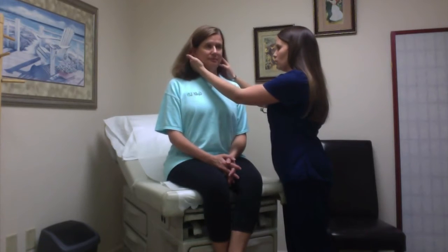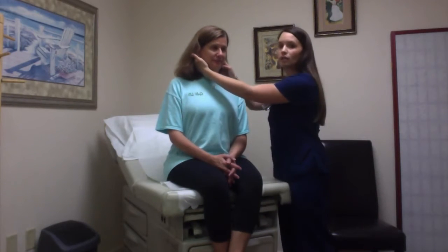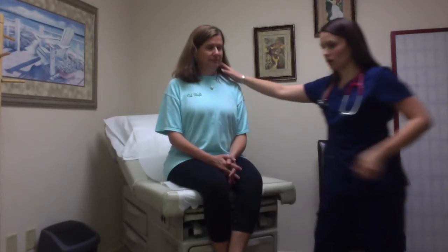Okay, so next we're going to be doing the assessment of her ears. I'm going to start by inspecting the auricle of each ear, just for any nodules, lesions, just general hygiene. I'll do both sides. Are you feeling any tenderness in your ears? No tenderness. Okay, so I'm also palpating. I'm going to palpate your mastoid process. Do you have any tenderness in your mastoid process? No. Okay, good. Now for the otoscopic examination.